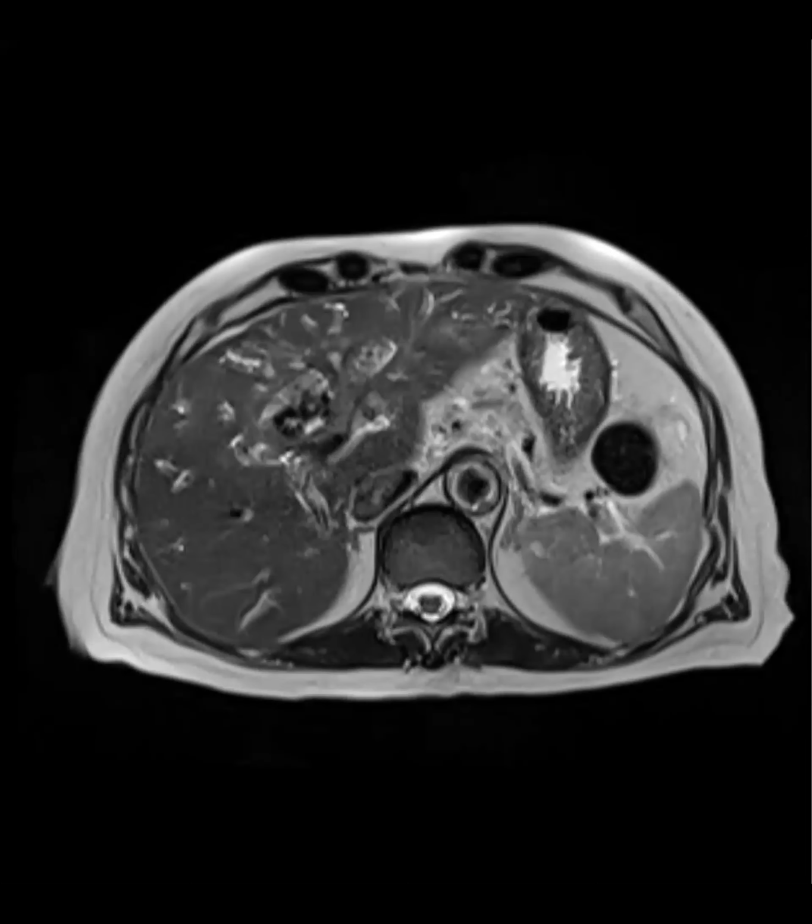So this is a case, and then the MRCP I thought was really great because it's just a great example of what ischemic cholangiopathy, chronic ischemic cholangiopathy can present with. You get central ducts, which are markedly diminutive, and then the peripheral ducts are dilated. So I thought this was a really beautiful case of what ischemic cholangiopathy looks like after addressing the obstructive component.